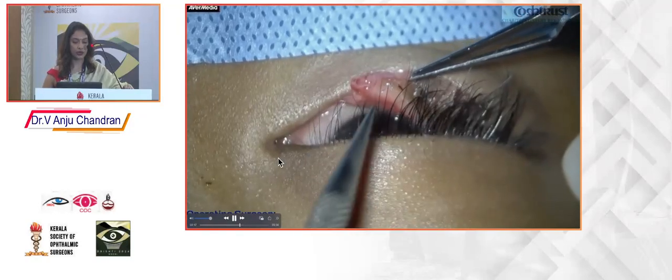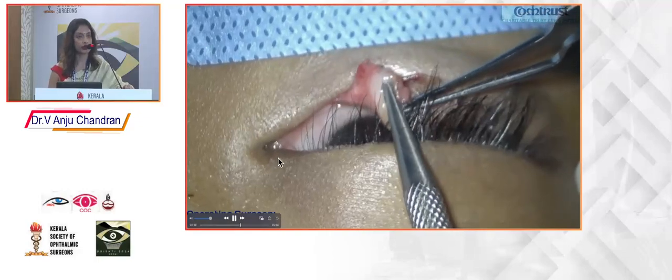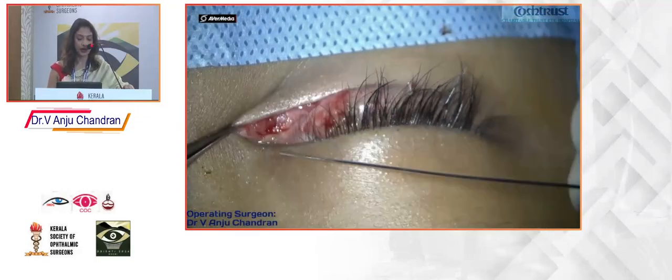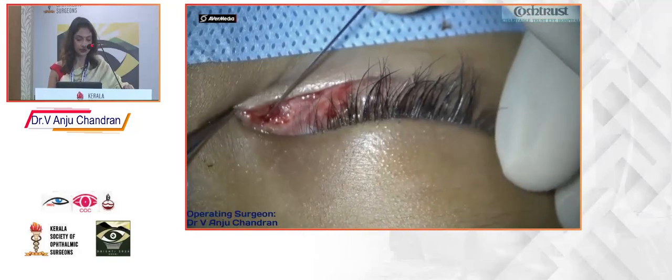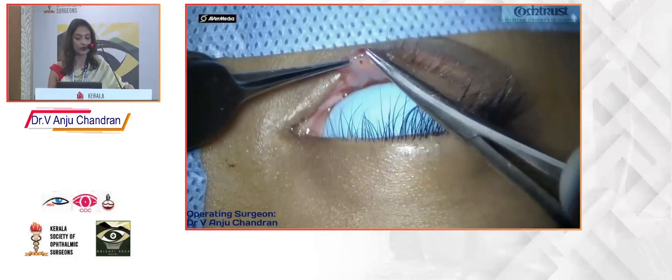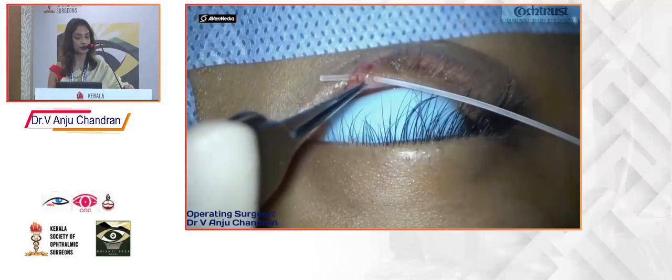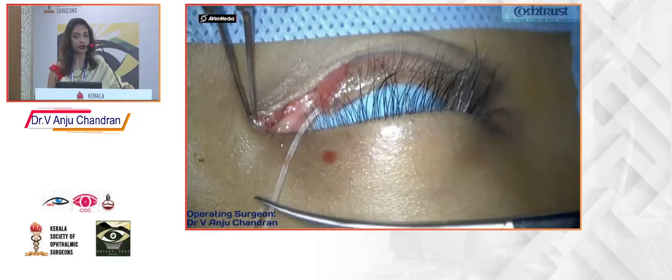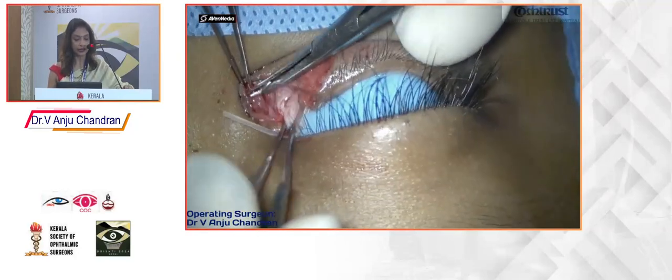This is a quick video where we begin with punctum dilatation, as in all lacrimal injuries or cases. Identify the distal cut end. Here you can see the calamari sign very easily. Here I have used a mini Monoka, which is being inserted into the cut end and into the puncta. You can trim it according to the need and the ease of placing it.